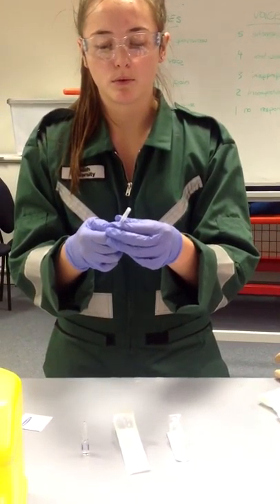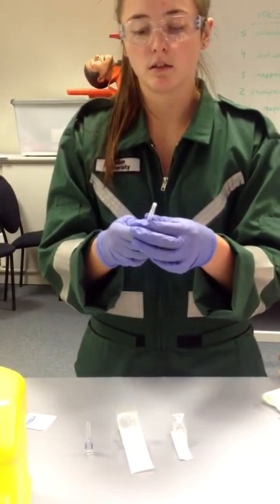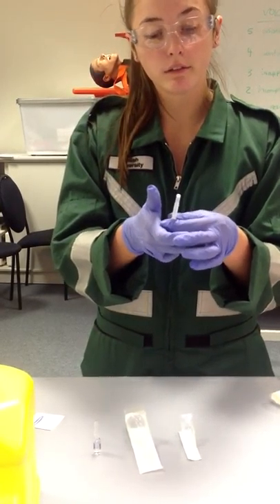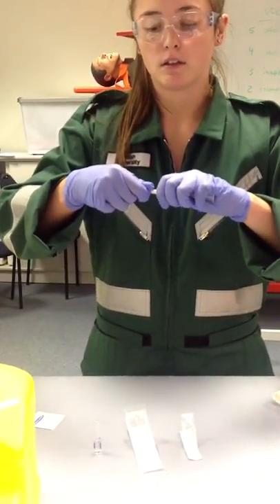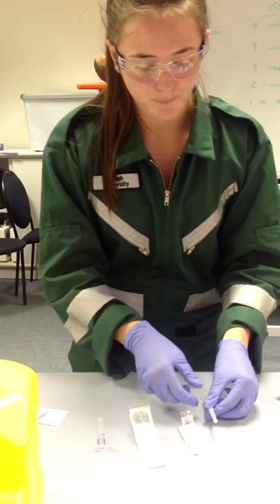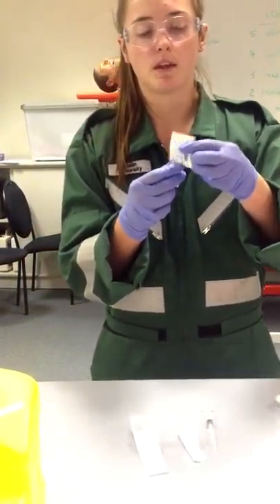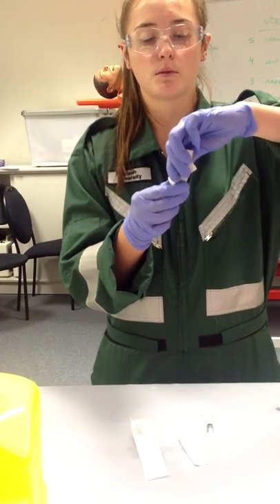I'm just going to pull that cap off there so it's nice and loose when I need it. There we go. I'm just going to break the top of this with this swab here so we don't get glass anywhere, like so.